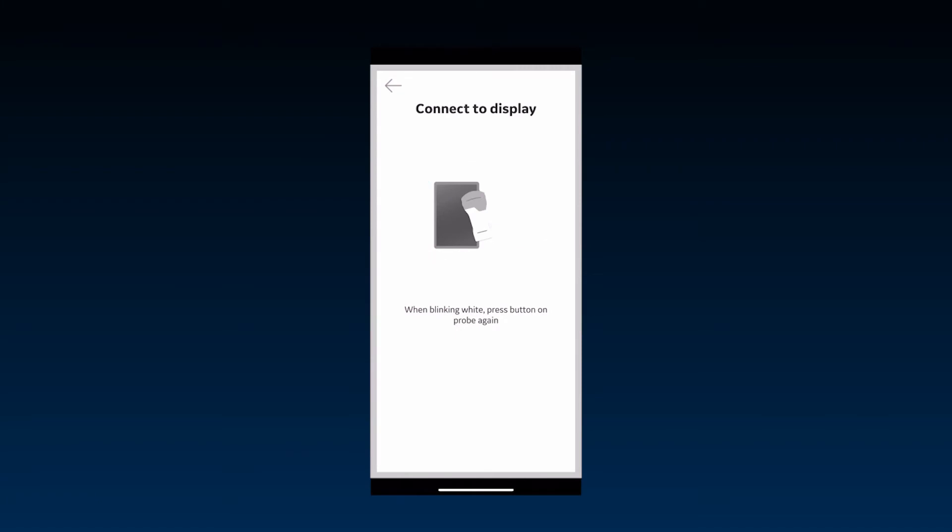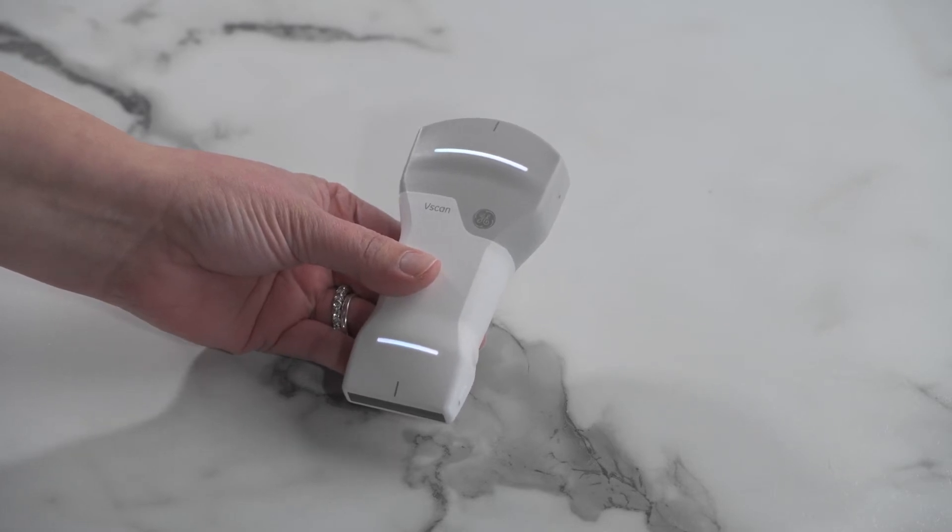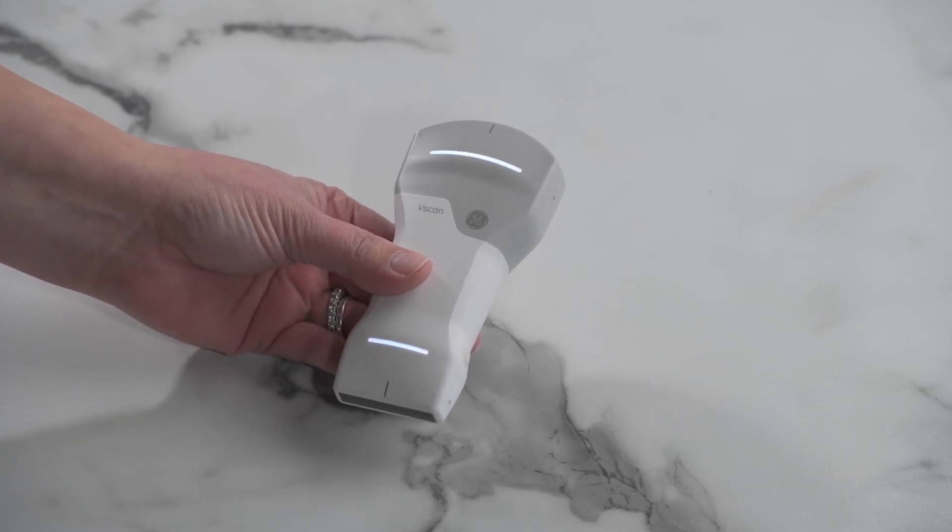If pairing for the first time, press the power button to confirm a connection. Once the app is detected in the vicinity, the LED lights will turn to a steady white on both sides.